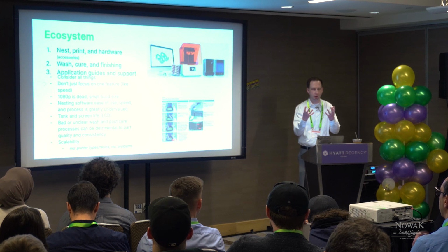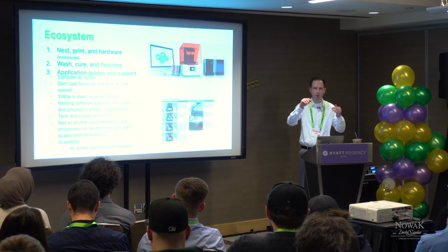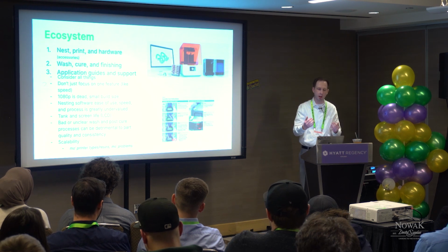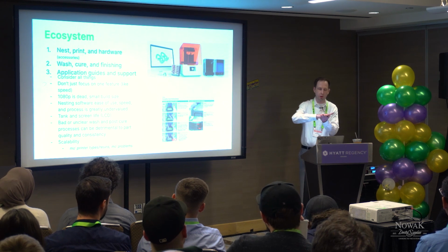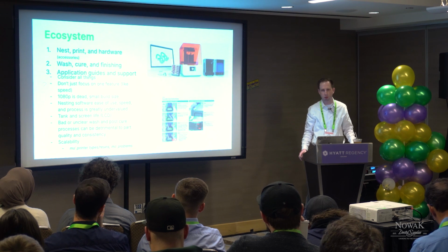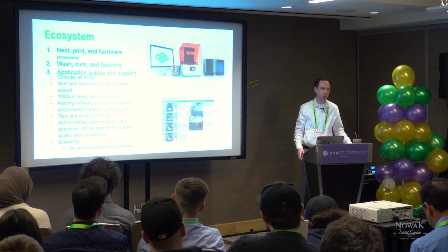3D printing is the light getting to the resin, and anything in between, either glass or the tank film, is in between, right? So the life of the tank makes good prints. The way it's handled, the way the surface, the part peels as it lifts, it all makes a huge difference. And if you clean it incorrectly, you'll start having bad prints and delamination.